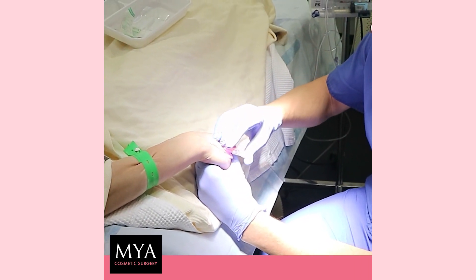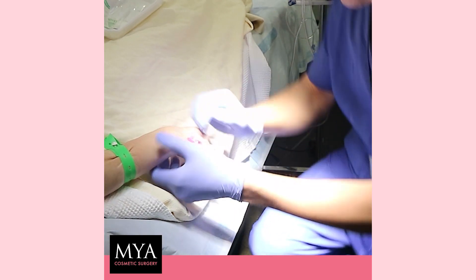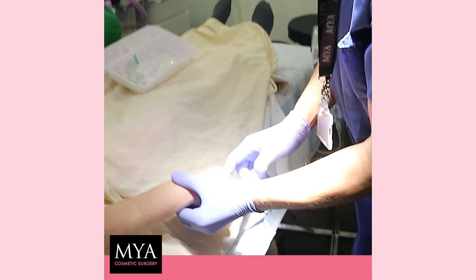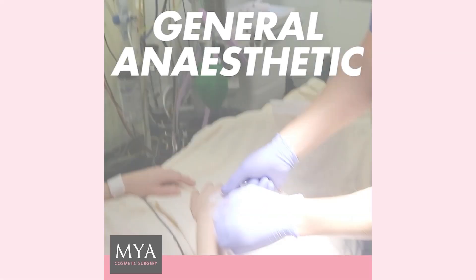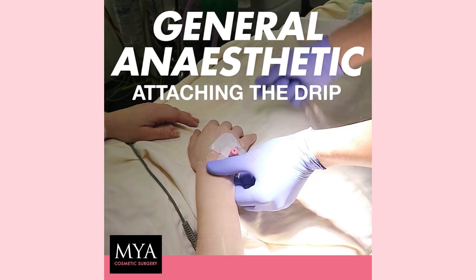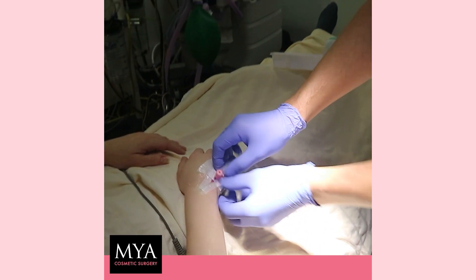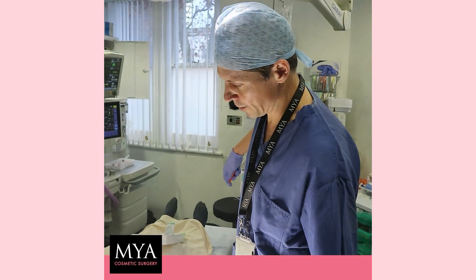Sharp scratch. That's it. Nice and easy. All done. So the needle's coming out — just a small plastic cannula. Just attaching the drip, and there'll be a bit of a sedative going in as well with the drip. That's how we start an anesthetic — some fluid to hydrate our patient during the procedure as well.